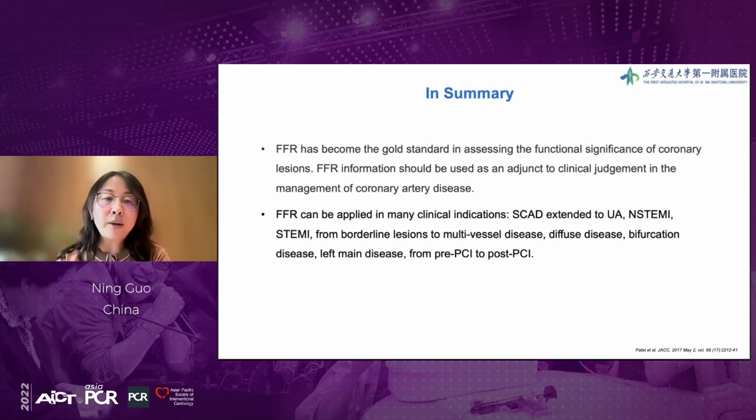And FFR can be applied in many clinical indications, from stable angina extended to unstable angina, non-STEMI, STEMI, from borderline lesions to multivessel disease, diffuse disease, bifurcation, and left main disease, and from pre-PCI to post-PCI. Thanks for your attention. Thank you.